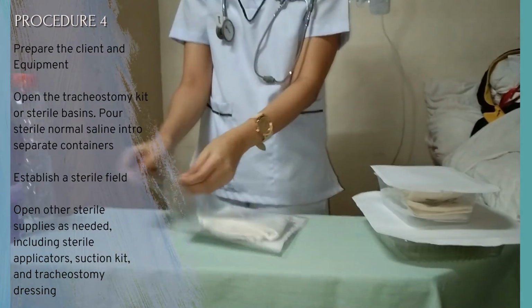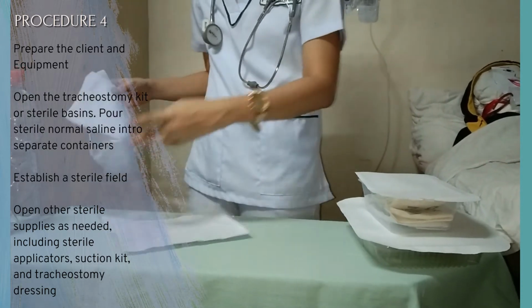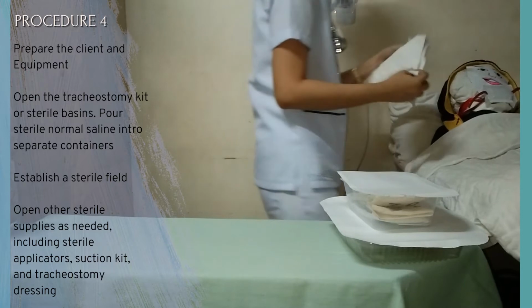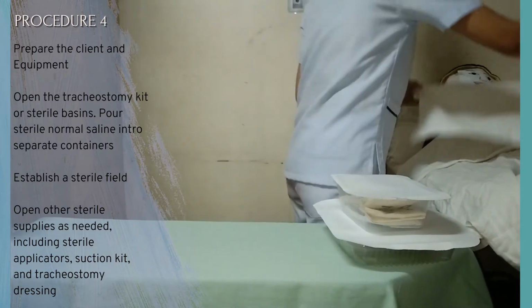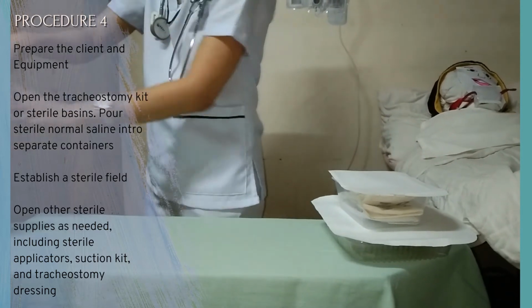Open the tracheostomy kit or sterile basins. Pour hydrogen peroxide and sterile normal saline into separate containers. Preparing equipment allows for smooth, organized performance of tracheostomy care. Then establish a sterile field. This is to prevent contamination and maintain sterility.